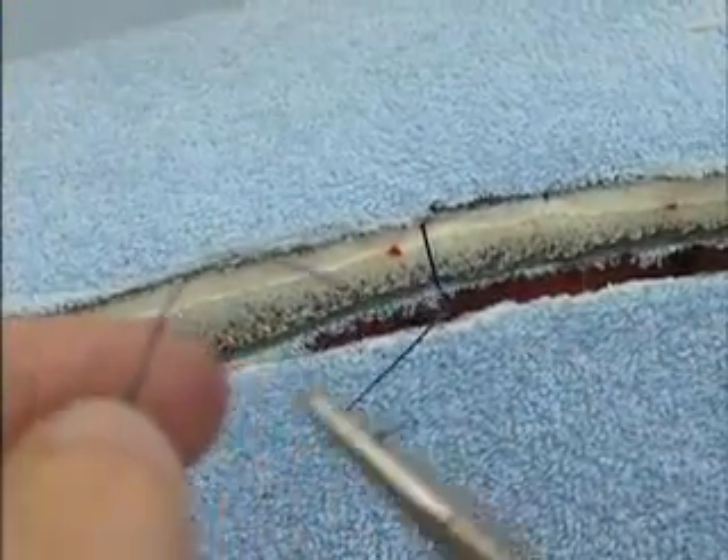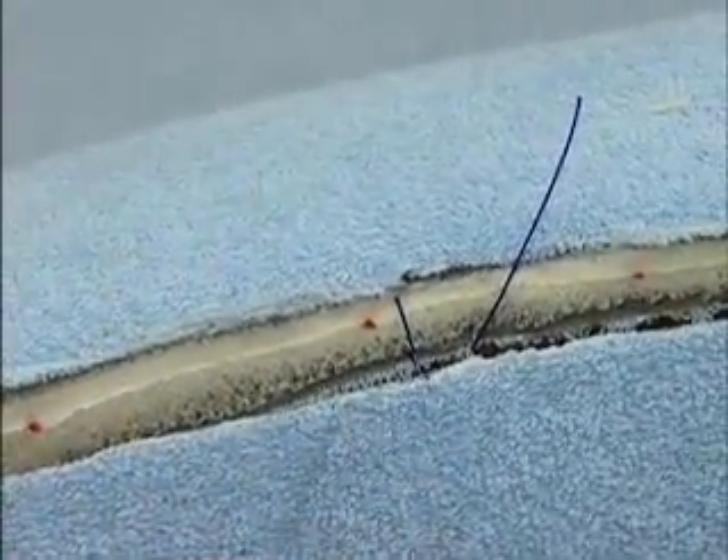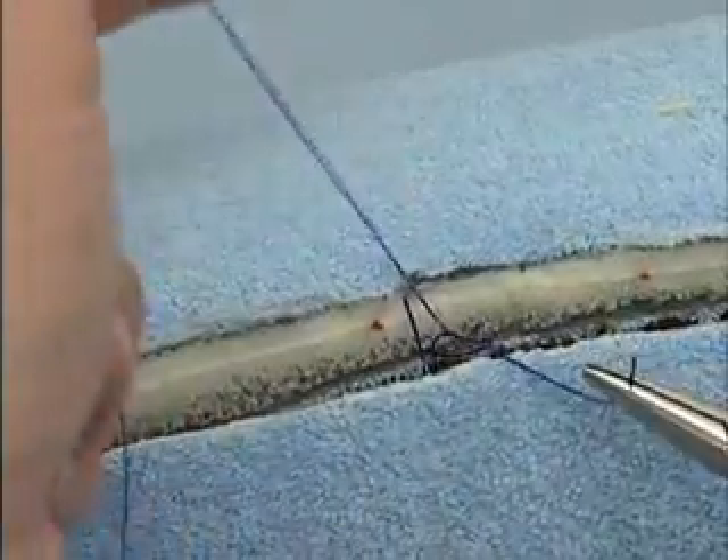I'm just trying to get both ends into the field for you. Tying the suture will bury the knot inside the incision.